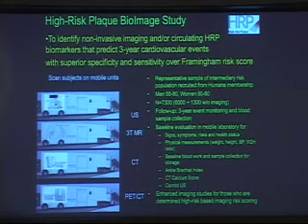The issue of the truck is interesting, because now we're doing this in a single place, in a parking lot, where half of the patient cohort is now in Chicago, doing the CT, the MRI, and the ultrasound in the parking lot.